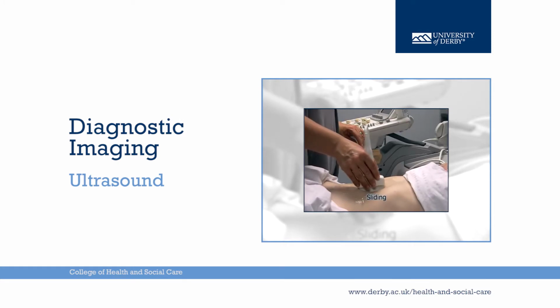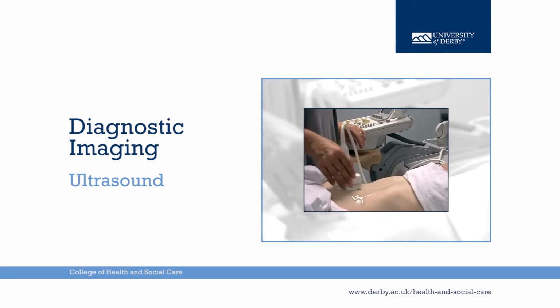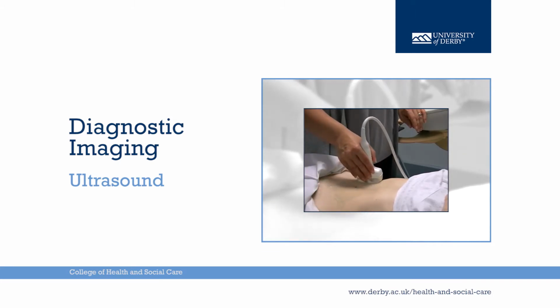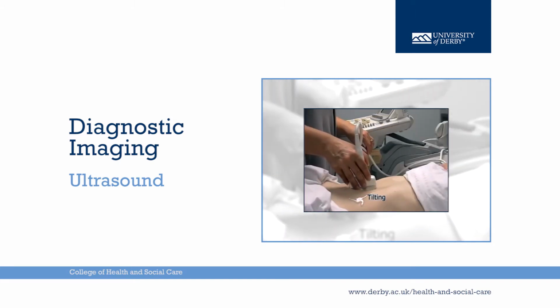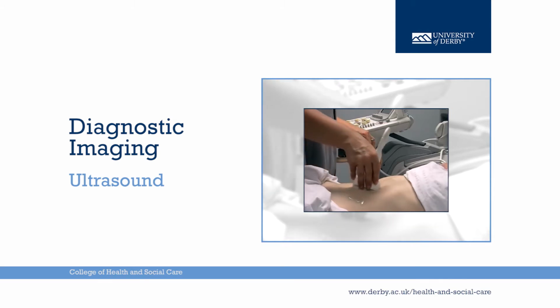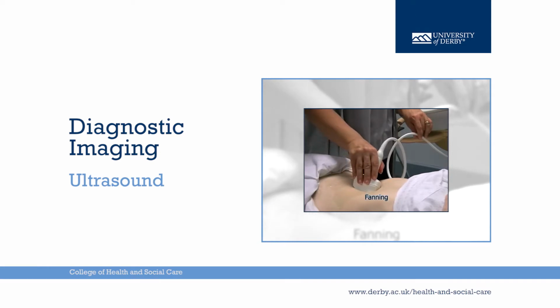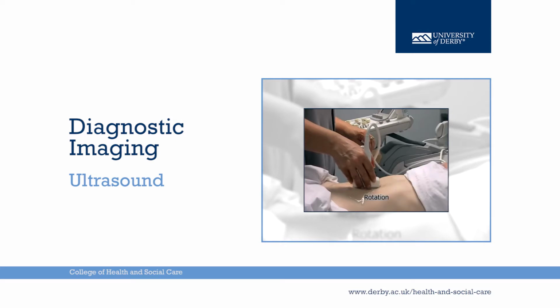Sliding. Tilting. Gentle tilting one side to the other is referred to as fanning. Rotation.